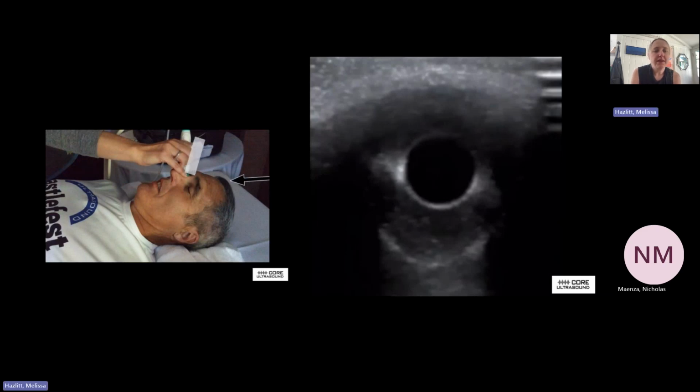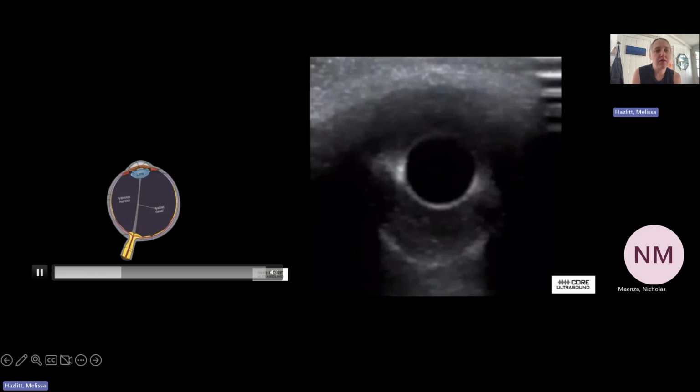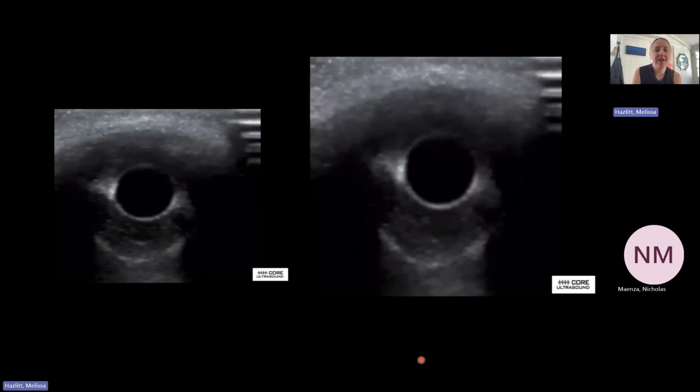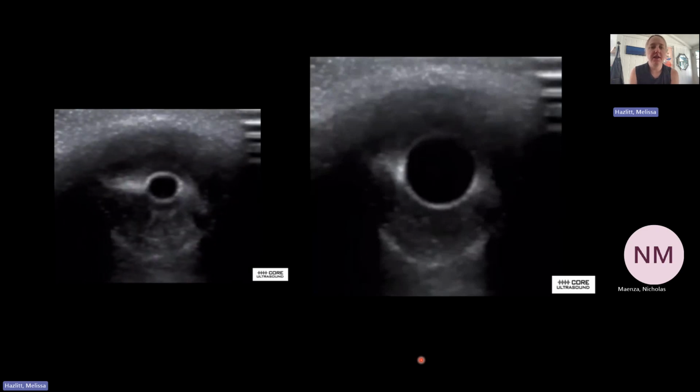And then you basically tilt the tail towards the head of the patient, and you're looking down through the eyeball, and then you're able to transect at the level of the lens right here. So then you're able to see that pupillary response too. I'll tell you, I tried this for a little while on one of our residents, and it was technically more difficult than just doing the transverse normal view, where you're just watching the area of the ciliary bodies surrounding the lens.